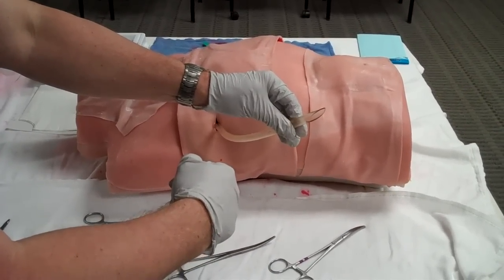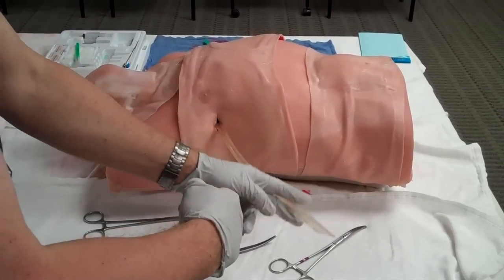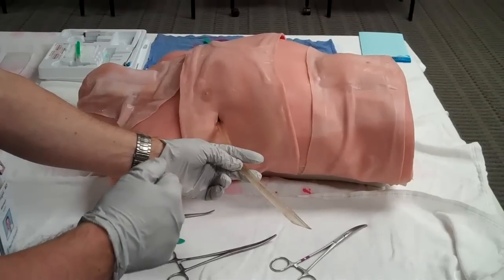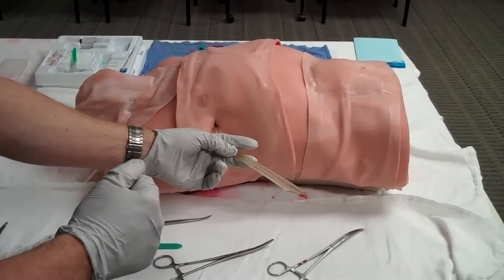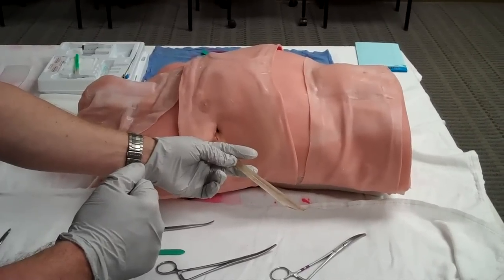Typically, this can be secured further by using banding guns or some other connection system. And then finally, it's just time to sew this up and put a nice dressing on it. Vaseline gauze is an option. Some people believe in it, some people do not. It's probably not necessary in most people unless you've made a very, very large incision that you're worried about.